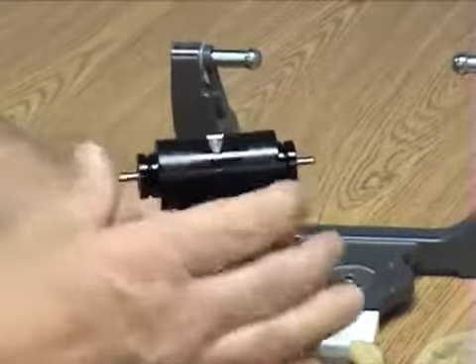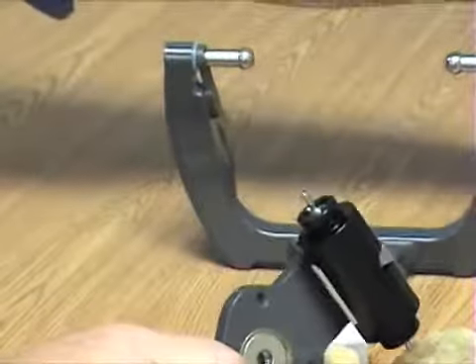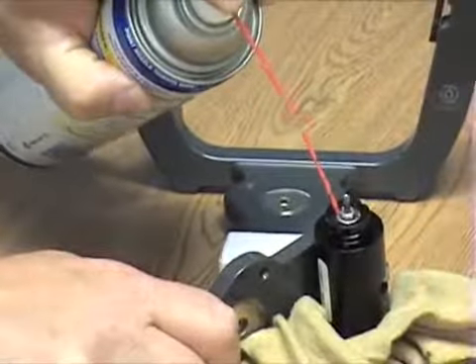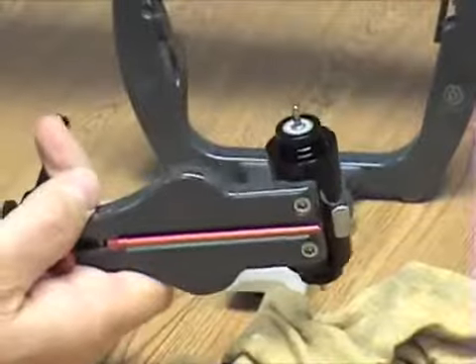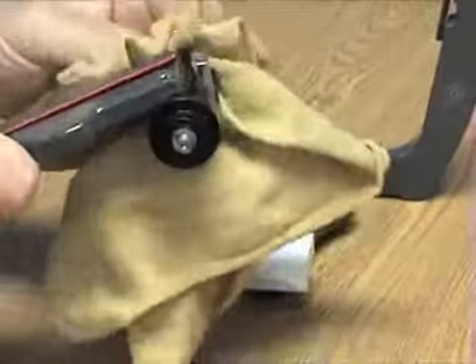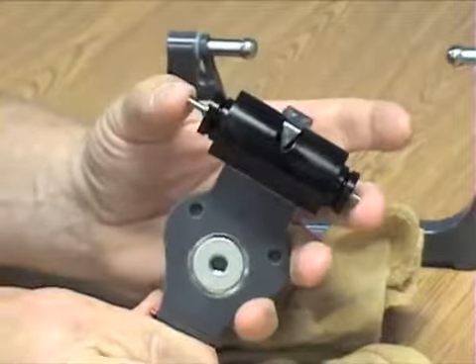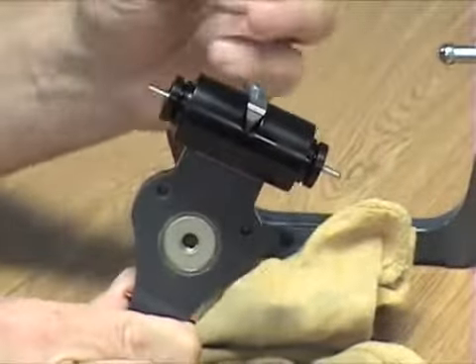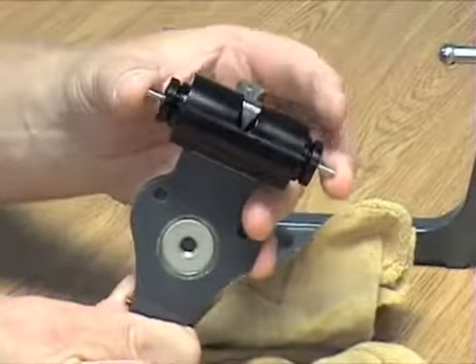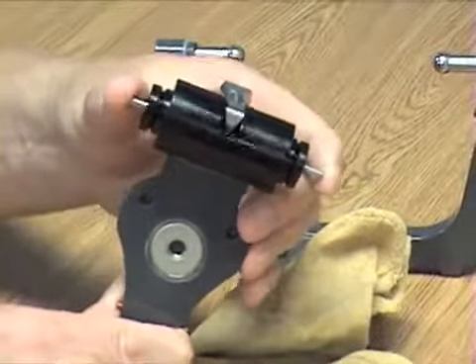If this is not happening and I'm feeling some drag as this goes back and forth, we can come in on the top side, give her a little squirt, and one on the other side as well. We make a mess of our bench, but we're used to that. Then we come back in with a rag and wipe the excess off. You're definitely going to see and feel the difference in cleaning out some of that grit from when you have your models on and you're doing your grinding, as some of that material can be pulled in there. This will help wash and clean that out and give a nice lubrication to both metal surfaces so they will move freely for you.